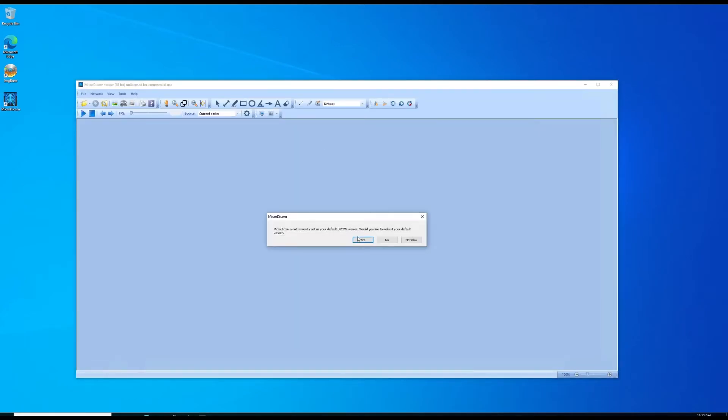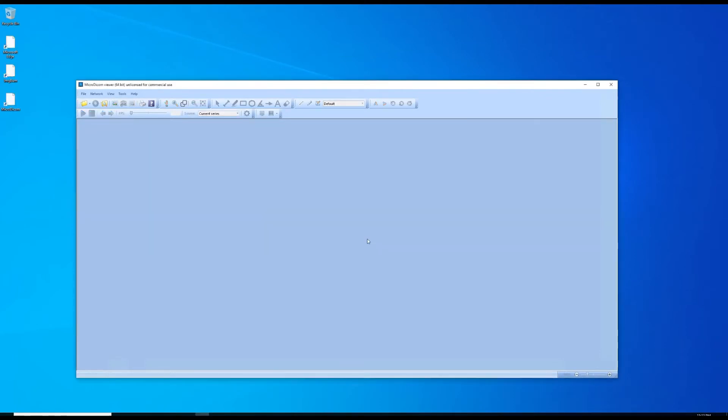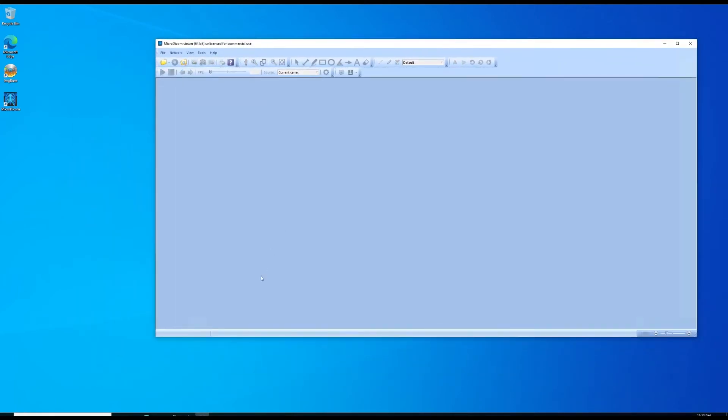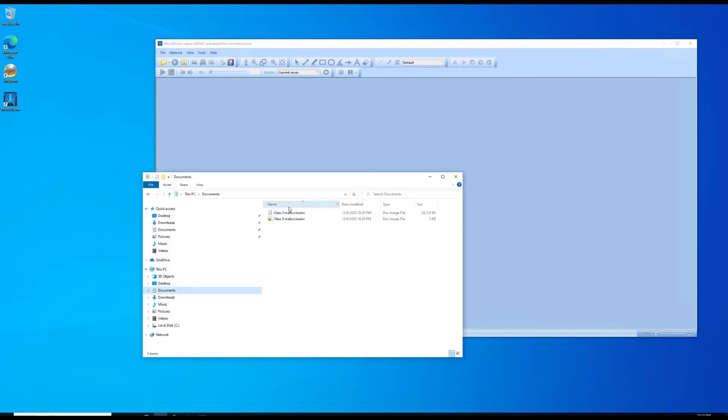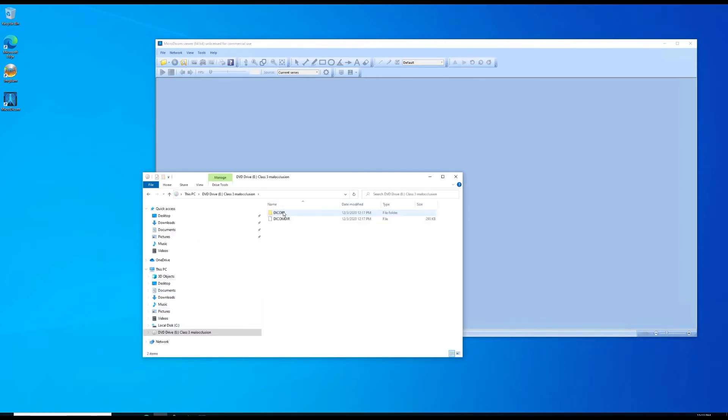MicroDICOM is open. Let me go get that image. It's in my documents folder. Double click it. It mounted as drive letter E.